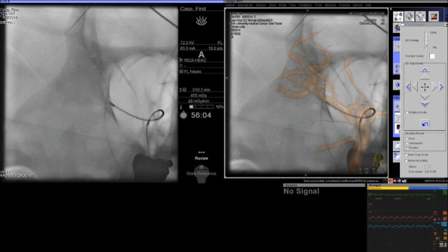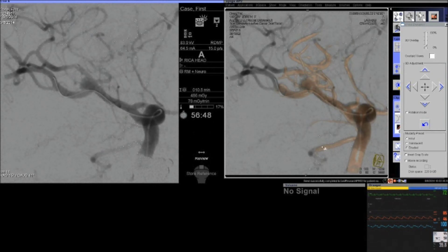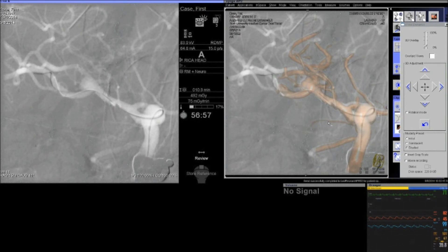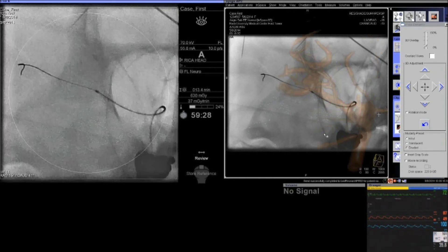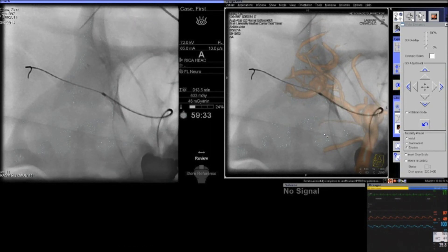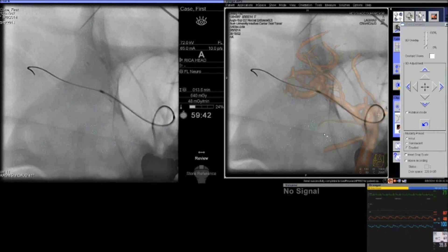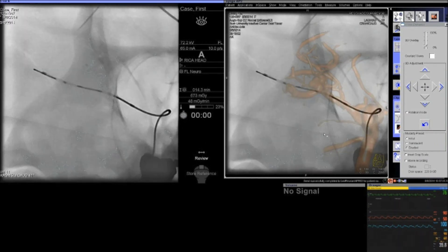Once the first stent is deployed, the microcatheter remains in position and you use the Synchro 14 wire to catheterize the second branch of the bifurcation. This is an extremely important part — it must be done without moving the first device. Once we get the wire across the cells of the first stent into the M2 segment, we obtain a distal wire position to direct the microcatheter through that cell. One has to magnify and see very well the catheter passing through the cell. There will be a little bump as it goes through, and you adjust the wire and microcatheter position to find the soft spot to pass right through the cell of the stent — all without moving the first stent.